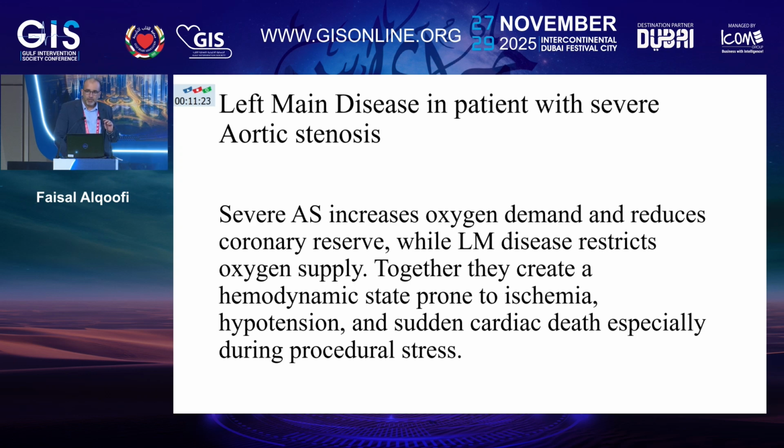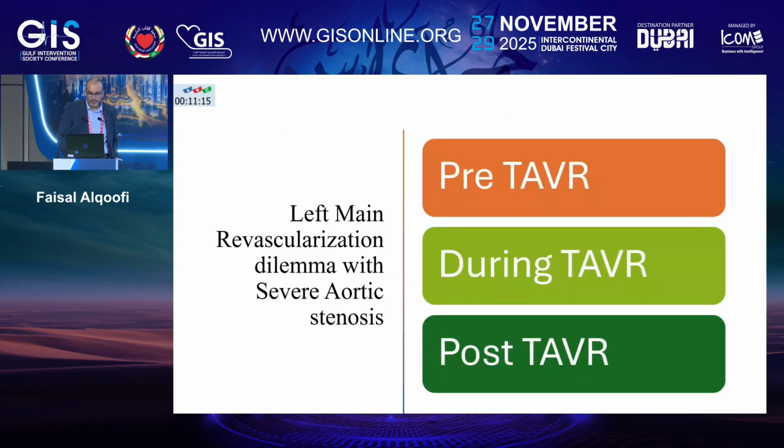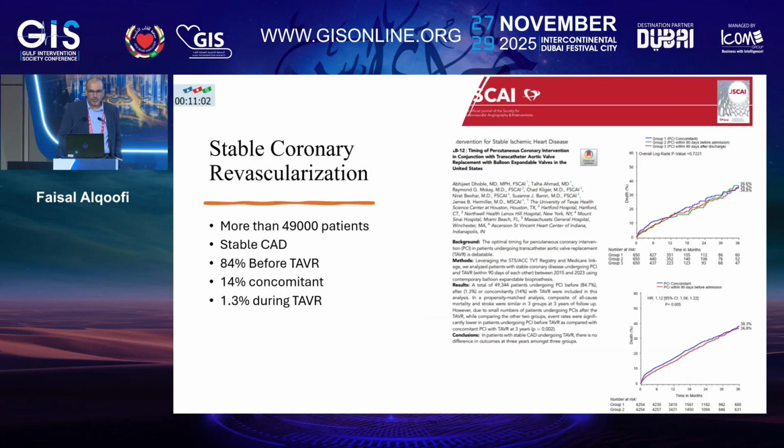In answering the question from the literature, we look for some guidance, but unfortunately, I might leave you with some more questions towards the end of the first part of the talk. So, do we do it pre-TAVR, during the TAVR, or post-TAVR? That's an important question when we discuss stable left main disease outside the realm of aortic stenosis. So we look for some guidance, and most of the published reports were around stable coronary artery disease.